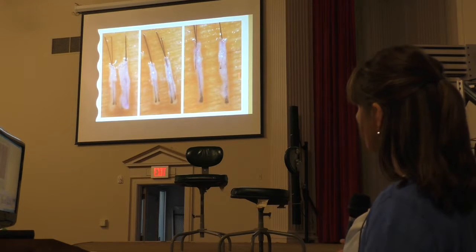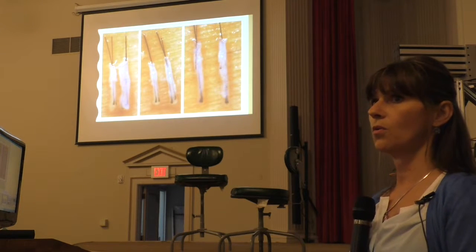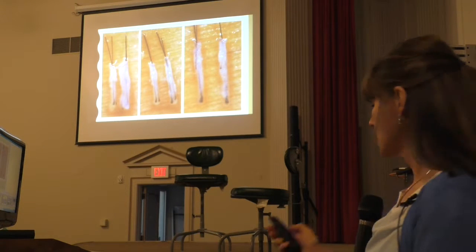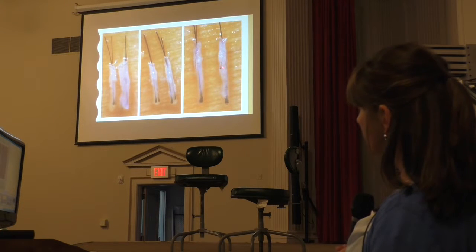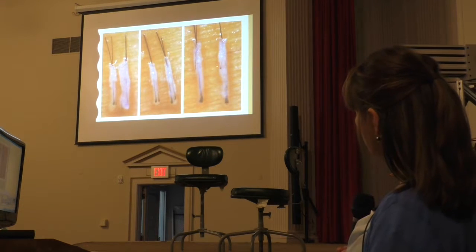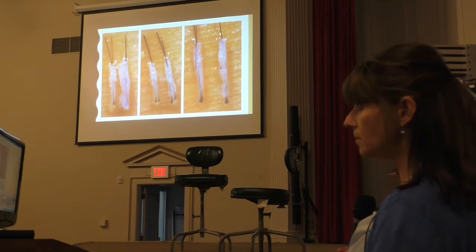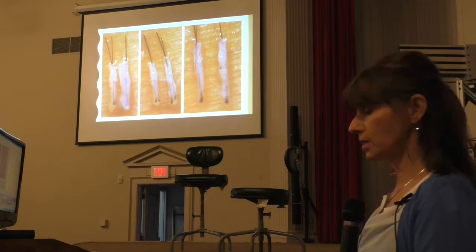Anyone want to tell me, is there any difference between these 2 grafts? Yes, no? How many would say yes? Okay, yes. So the difference is, this one is transected, this is a telogen hair. How I know the difference is, I see that there's a little bulb on the bottom. It tells me that this one was transected and this still has it.